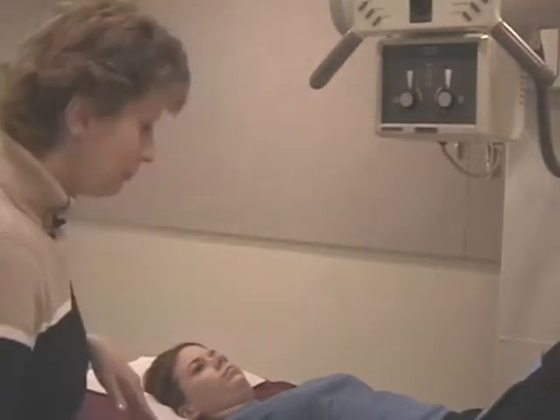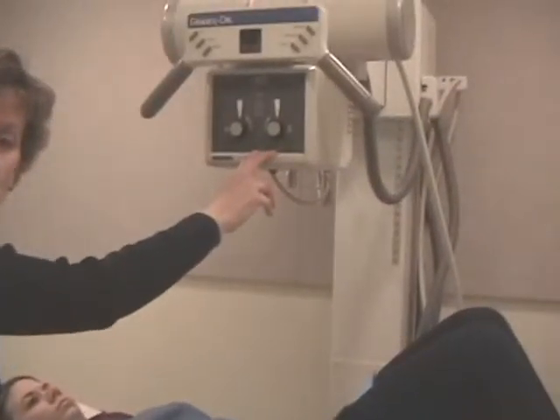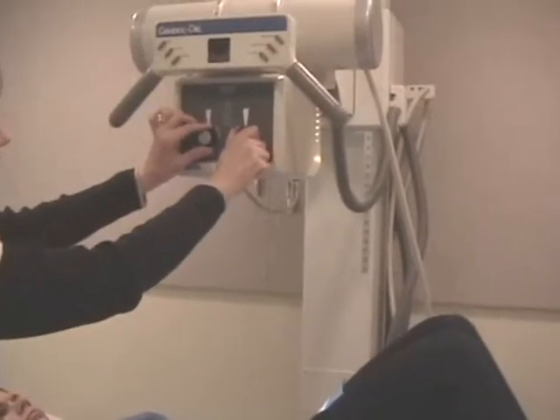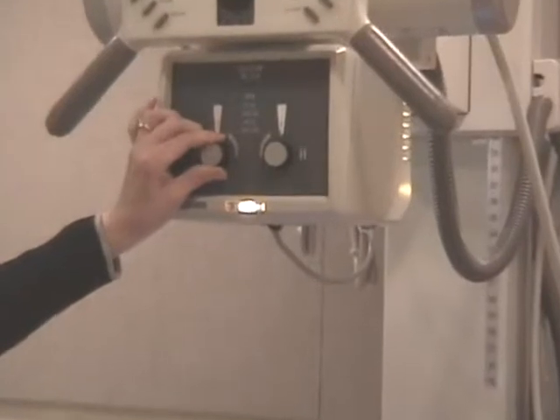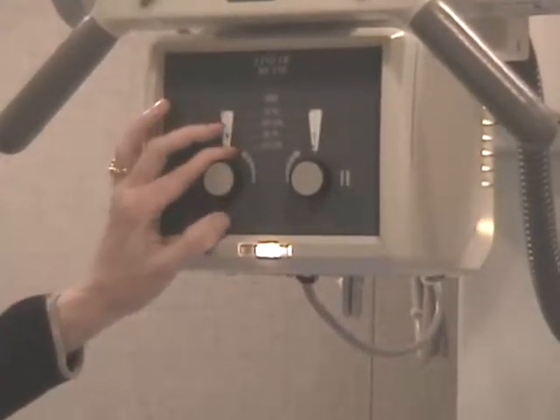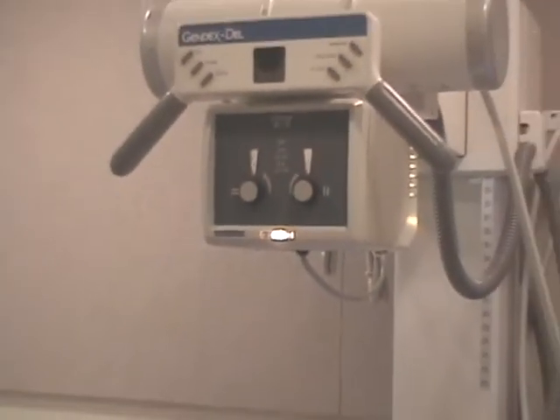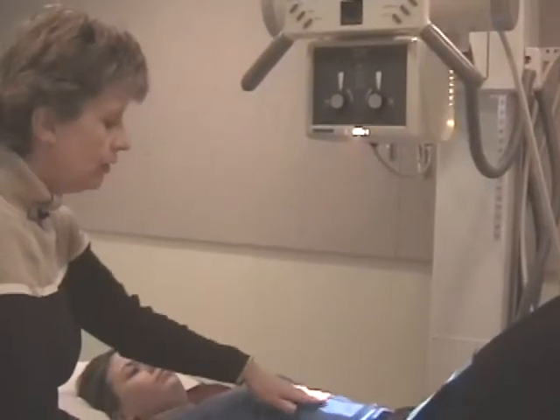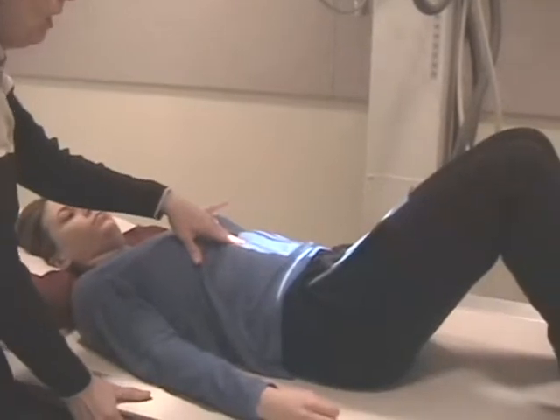Okay. We're going to talk about part film reference points and actually position them on the patient now. Your collimation is going to be 17, and we're going to go approximately 10 inches on the gauge. That will give us 2 inches of collimation on both sides. Your part film reference point is the mid-sagittal plane to the center of the film. We'll look down at the patient now, and I'm going to float my table.